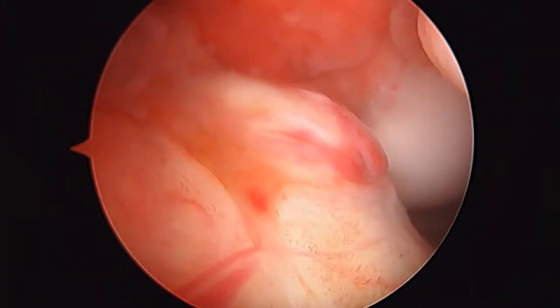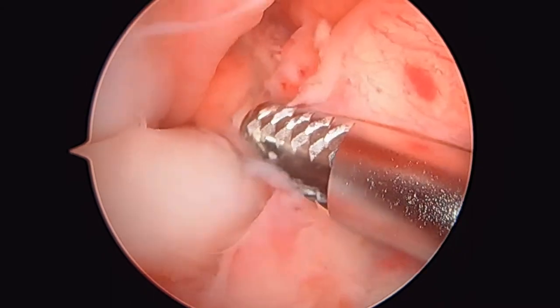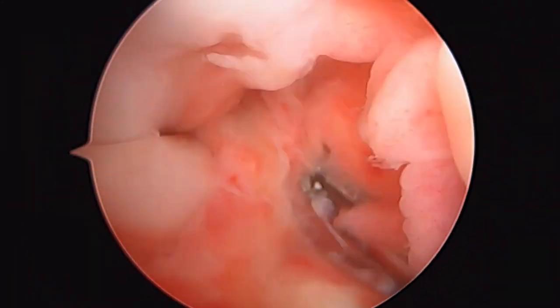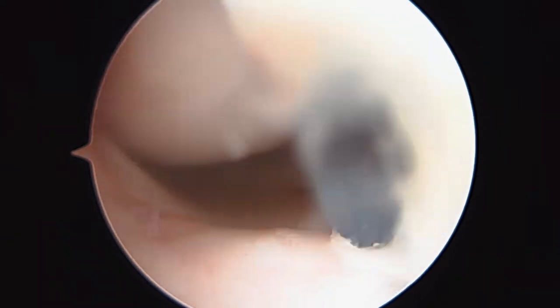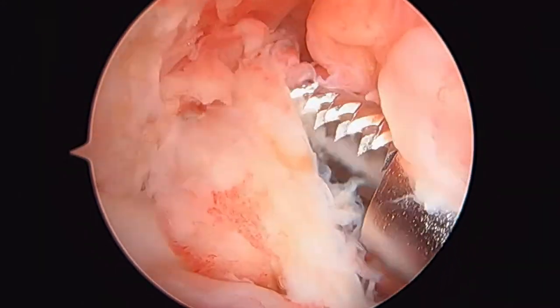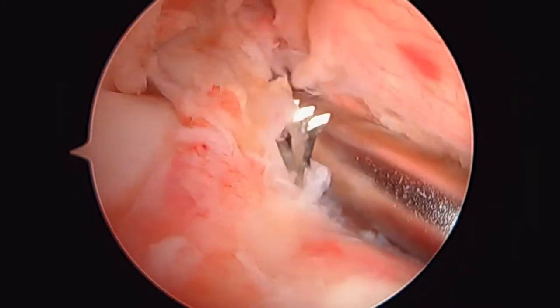Now we're going to look over at the central part of the knee, and this is where the ACL has been torn. You can see there's just a strand here that's maybe still attached. There's this stump that remains. We're going to clean up this area in just a minute. This is where the new ACL is going to run, but here you can see the damage to the old ACL — there's no way that's going to provide enough stability for you.